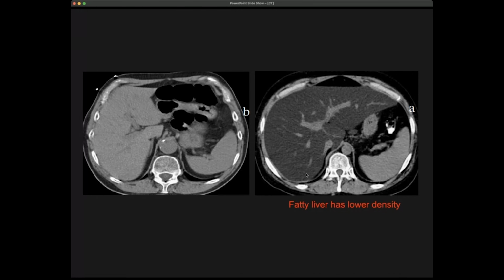What you see here is a liver which is actually darker than the surrounding tissue, so that means that its composition has changed. As we said before, fat has less attenuation. So when a liver becomes fatty, on average, its attenuation is less than a normal liver. This way you can partially use this appearance to make a bit more of a diagnosis. So again, you do tissue characterization based on interpreting the values of the X-ray attenuation that you measure and comparing them to different types of tissues that you know.